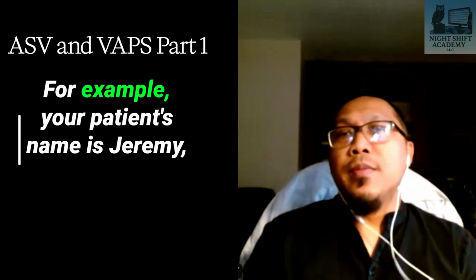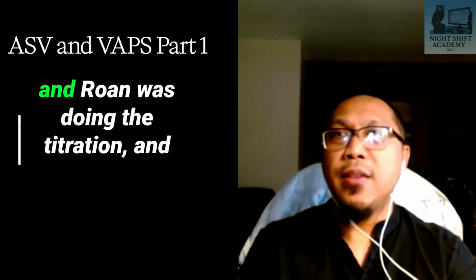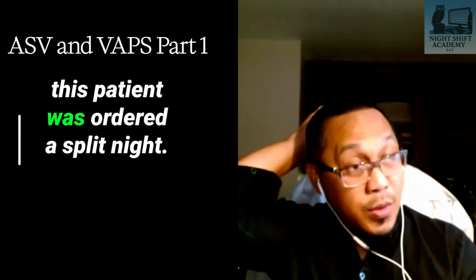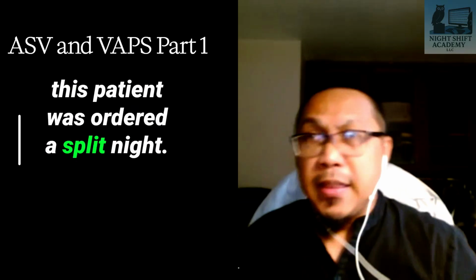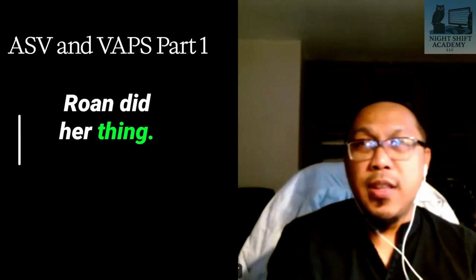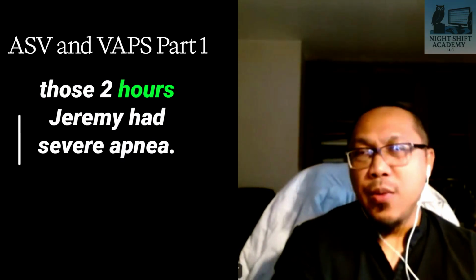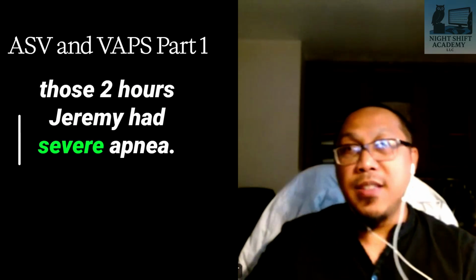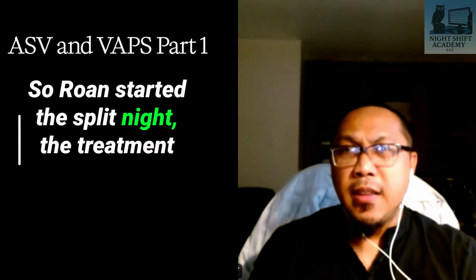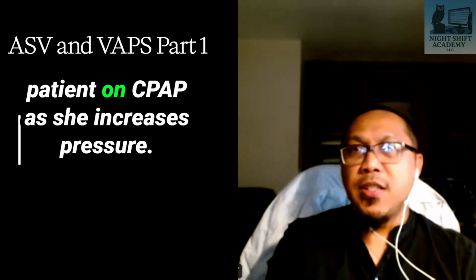For example, your patient's name is Jeremy, and Rowan was doing titration. And this patient was ordered a split night. So Jeremy was there for split night. Rowan did her thing. She did the 2-hour total sleep time. And within those 2 hours, Jeremy had severe apnea. So Rowan started the split night treatment portion with a nasal mask, and then put the patient on CPAP.